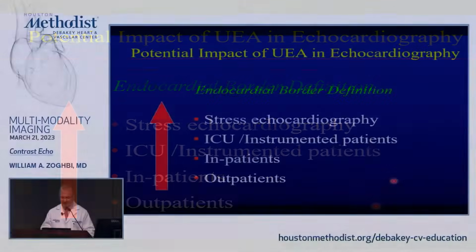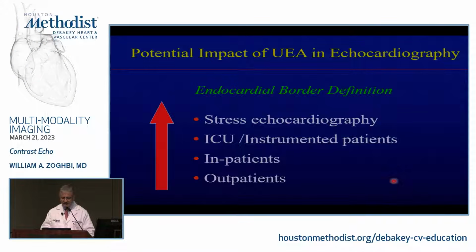So, potential impact of contrast. We did this slide many years ago, it has not changed. Inpatient setting, ICU, instrumented patients, definitely. Stress echocardiography, very important there if you don't see well. If you're struggling at baseline, you make sure that you get contrast at the baseline in addition to stress.